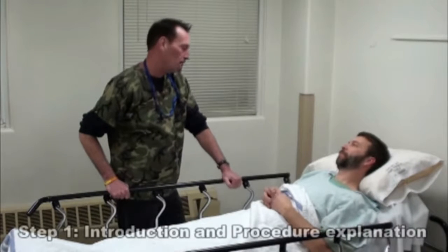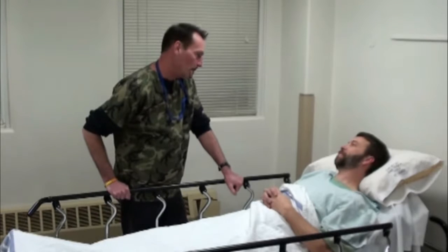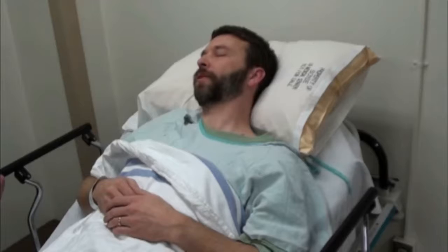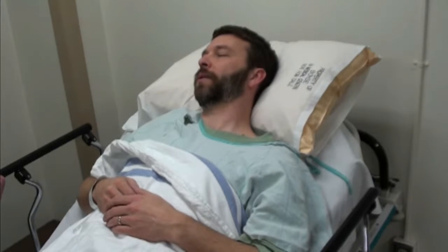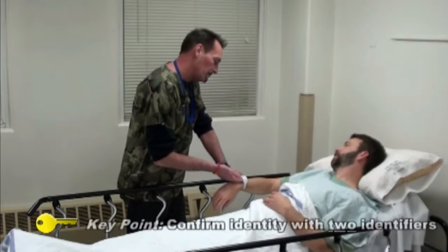Good morning, Mr. Harris. My name is Bryce. Good morning. And I'm going to be your CNA today. Nice to meet you, Bryce. You too. Okay, the doctor has ordered a procedure called straight cathing. What it is, we're going to temporarily insert a catheter and drain the urine from your bladder that you're unable to. We will not be leaving it in, it's just an in and out procedure. Okay? Okay, can I ask you to please verify your full name and full social for me? Mike Harris, 519-34-9876.